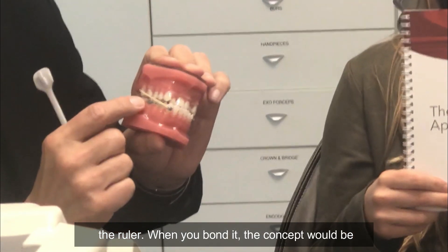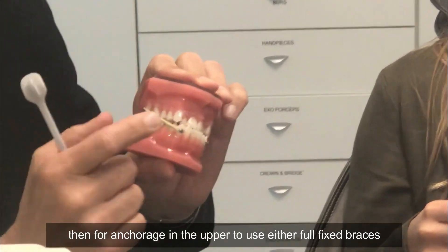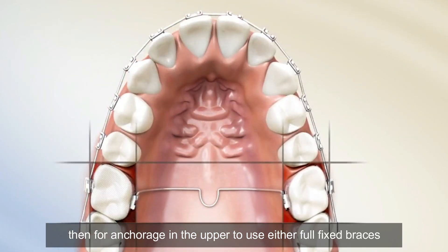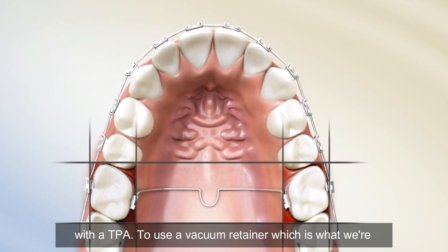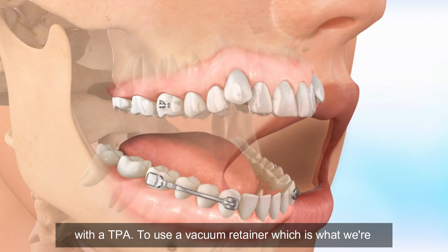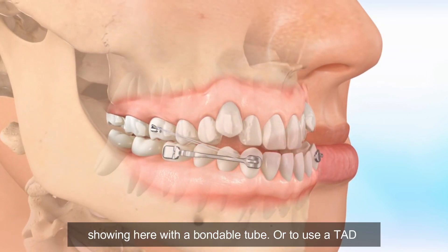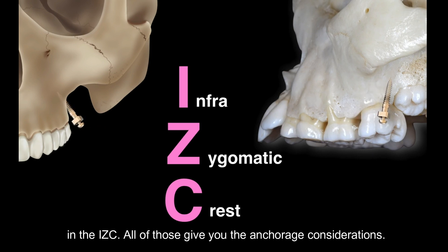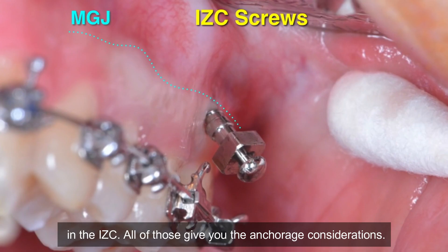When you bond it, the concept for anchorage in the upper is to use either full fixed braces with a TPA, to use a vacuum retainer — which is what we're showing here — with a bondable tube, or to use a TAD in the IZC. All of those give you the anchorage considerations.